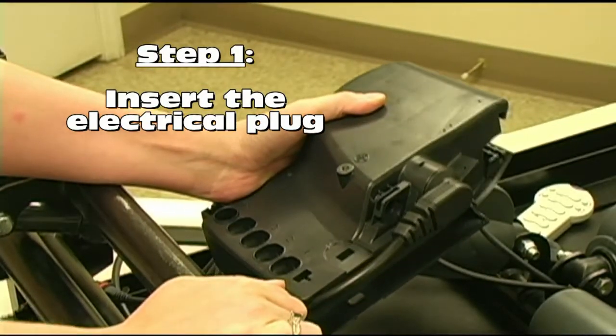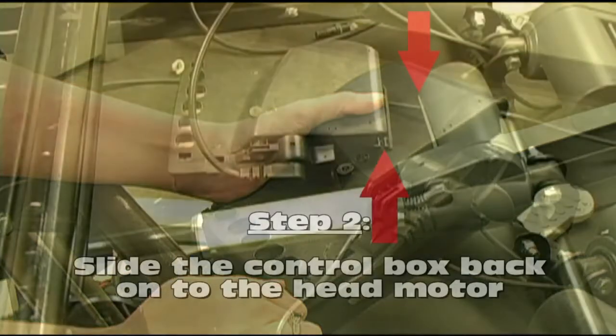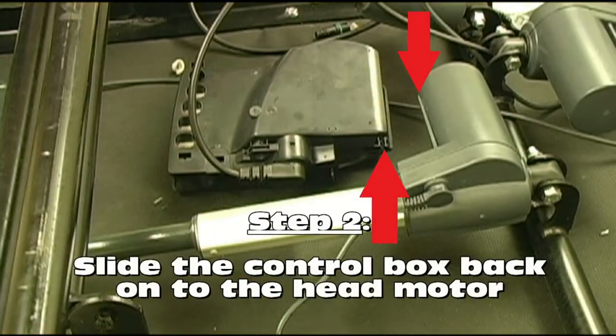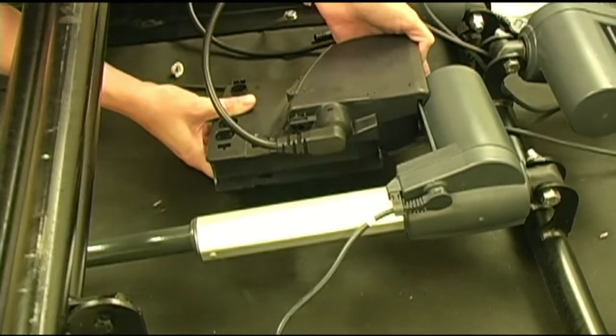Again, do not plug the cord into your wall receptacle until you have completely finished installing the new control box. Next, slide the control box back onto the head motor. You will notice the grooves in the control box should slide over the raised tracks on the cylinder of the head motor as denoted by these red arrows. Place the control box on the tracks as seen here and slide it all the way in.